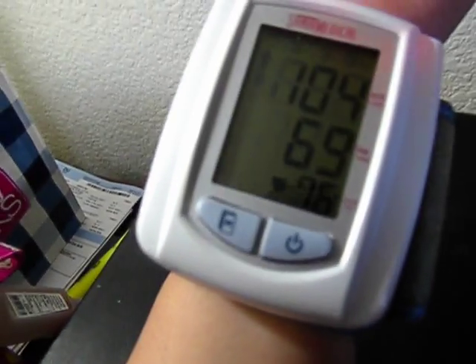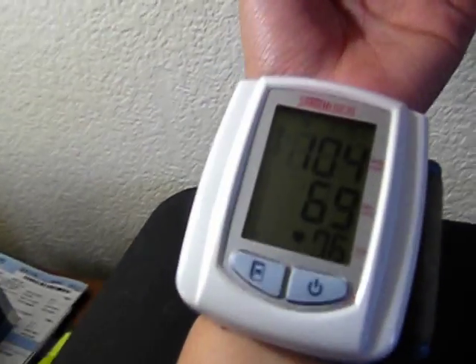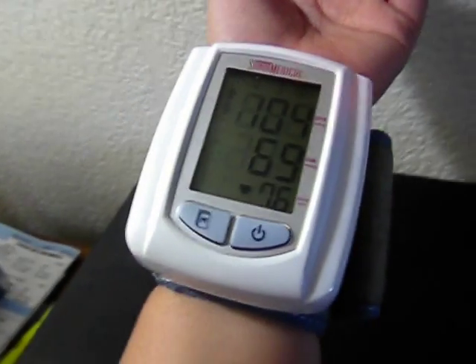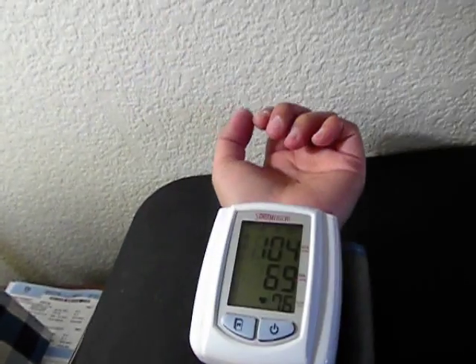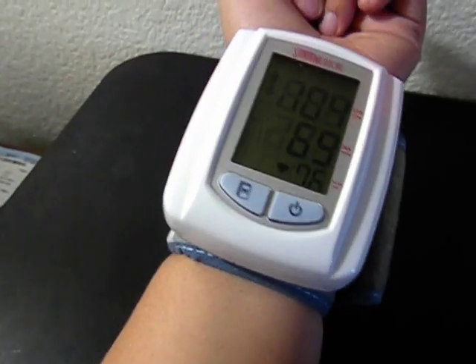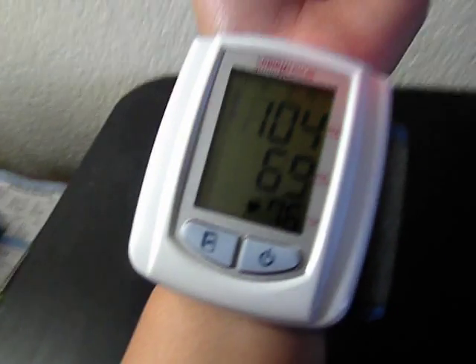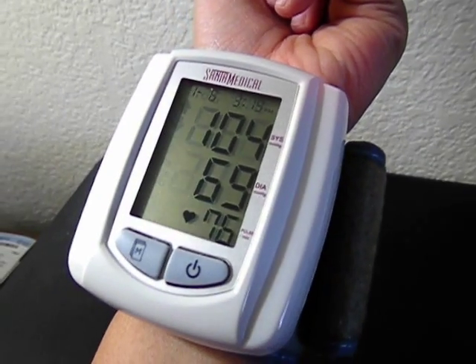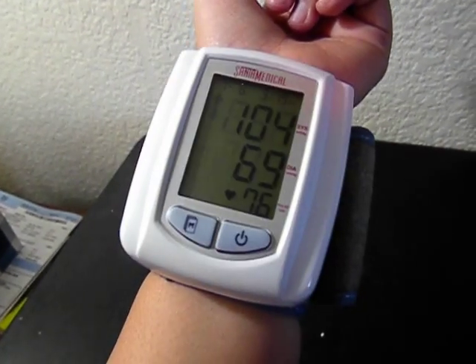I'm on the low normal side for the blood pressure. This is my normal blood pressure and it's very easy to use. It takes less than a minute to read my blood pressure and heart rate. So once you push the power button, don't move your hand or talk because that would cause some errors in the wrist blood pressure monitor. So that's it. I hope you found this helpful.